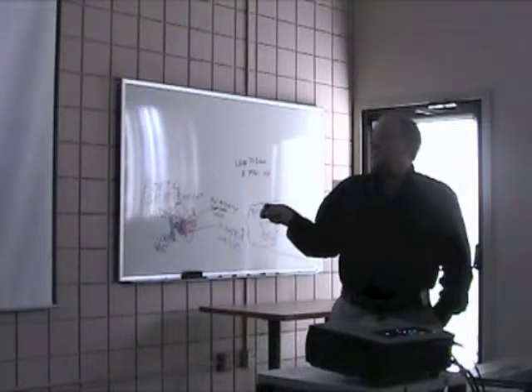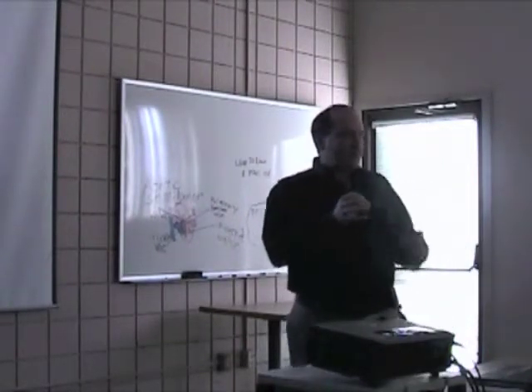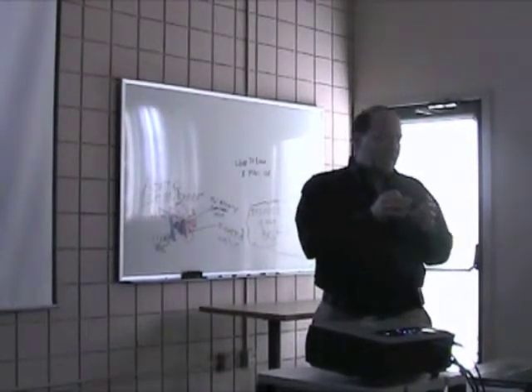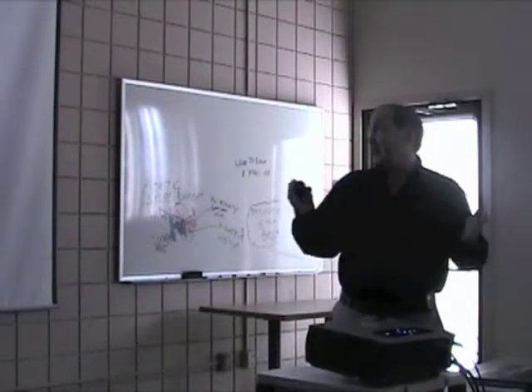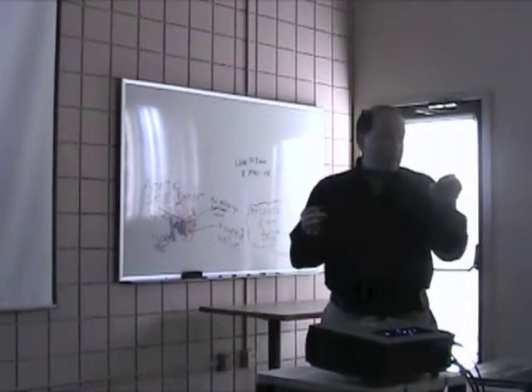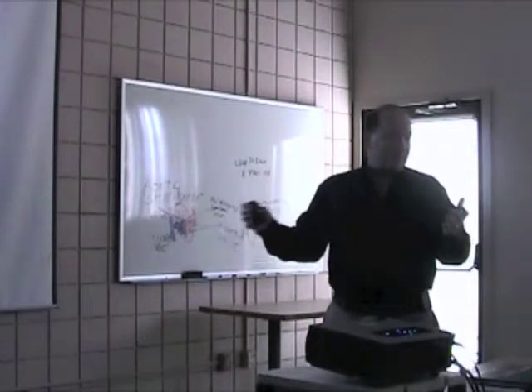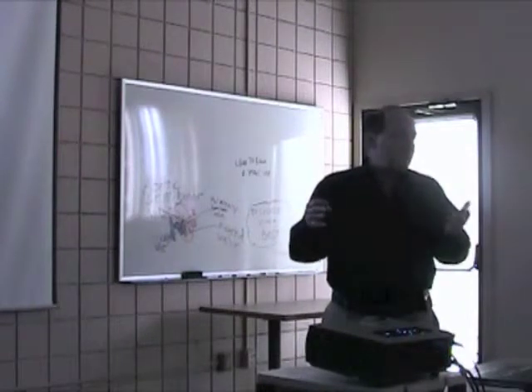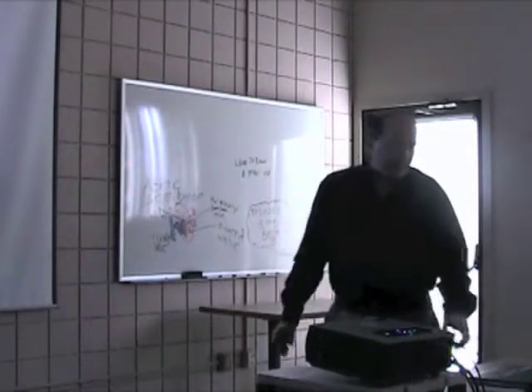If the root itself, that is the heart itself, is very, very calcified, sometimes it's hard to put a mechanical valve in there because the thing doesn't have a lot of give to it. And we may find we get in there, we have to put a pig valve in. And other people have a really small, tiny root, and if you compare a pig valve that we use to replace a valve with a mechanical valve, the mechanical valve has a little bit better flow. So some people have to get a mechanical valve because it's just so small. So there are some technical considerations.